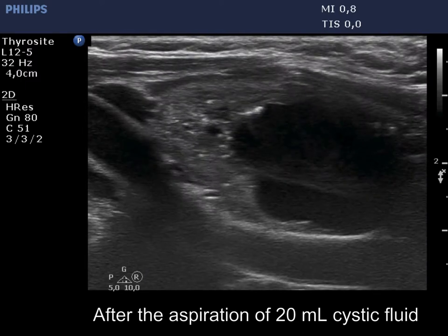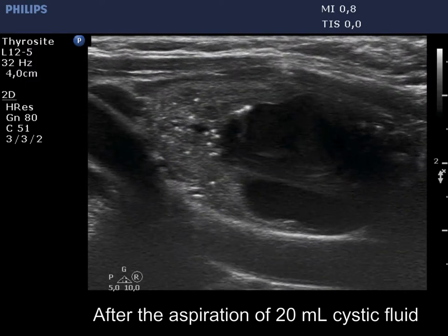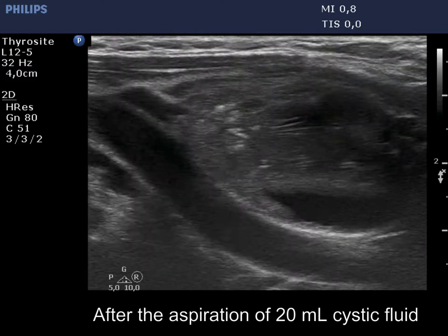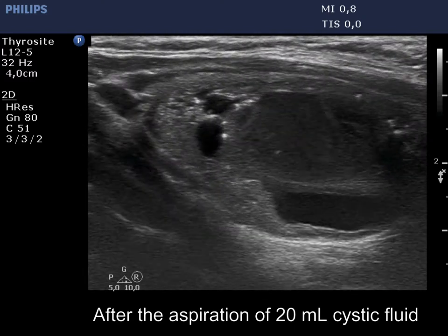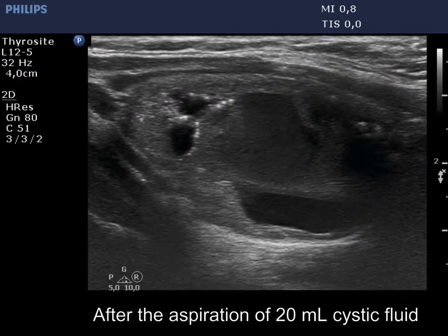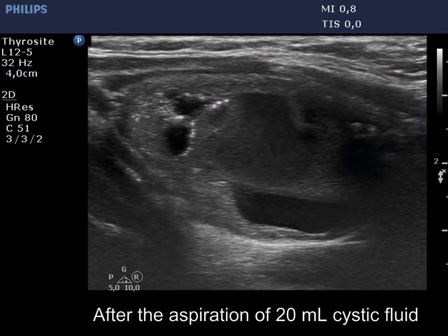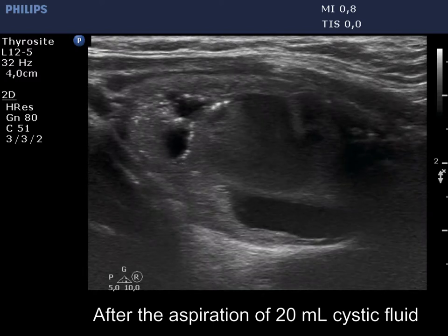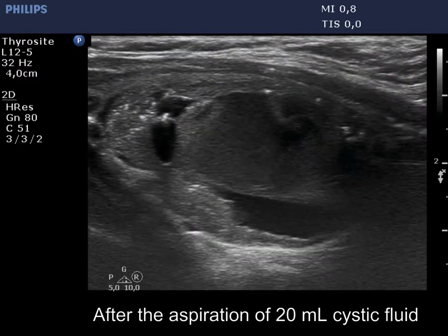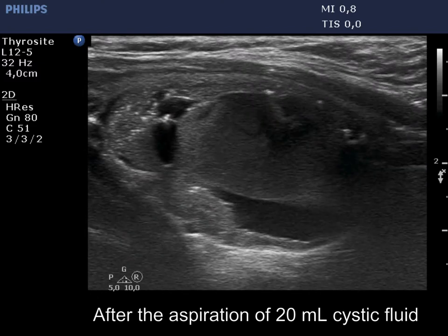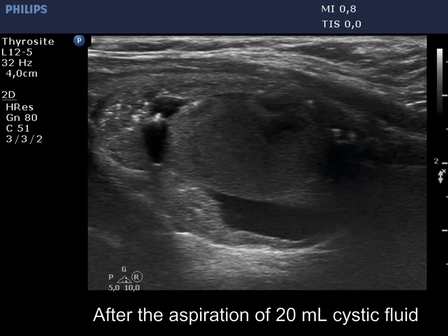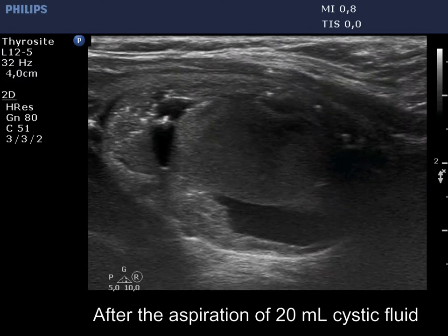30 seconds after aspirating 5 ml of bloody cystic fluid, the nodule is on refilling. The moving cloudy mass corresponds to fresh blood. The nodule has grown back to its original size.